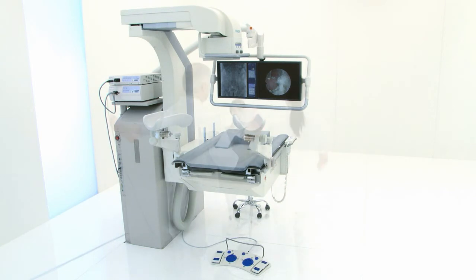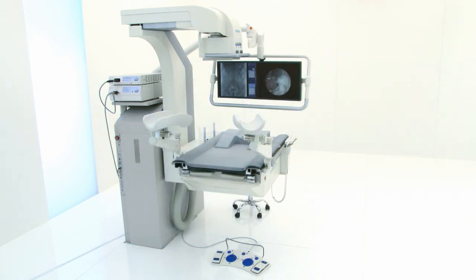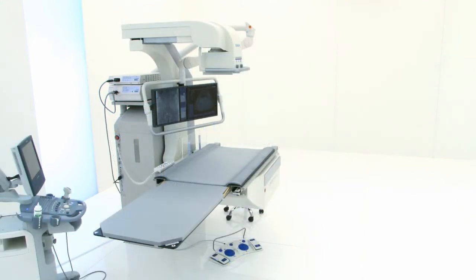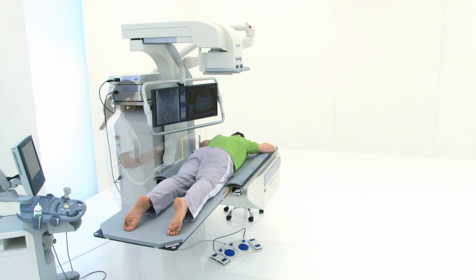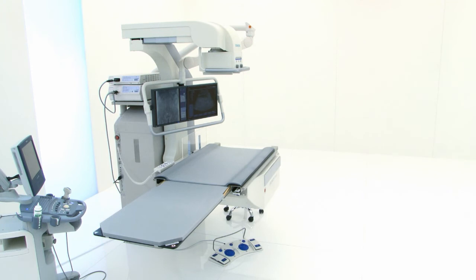Thanks to the flexibly movable monitors, you have an open and comfortable view of images from every working position. Having patient access from all four sides, there is no need to reposition patients or move anesthesia equipment.